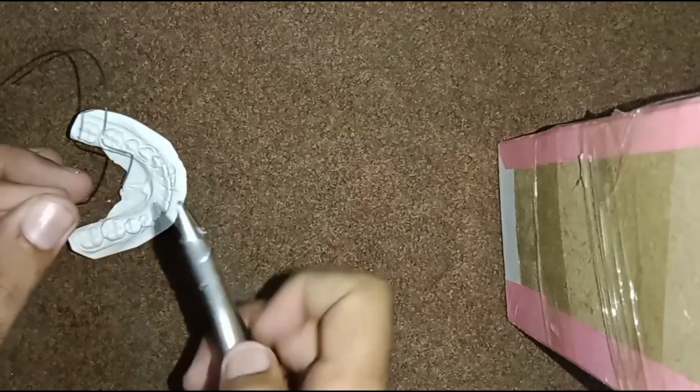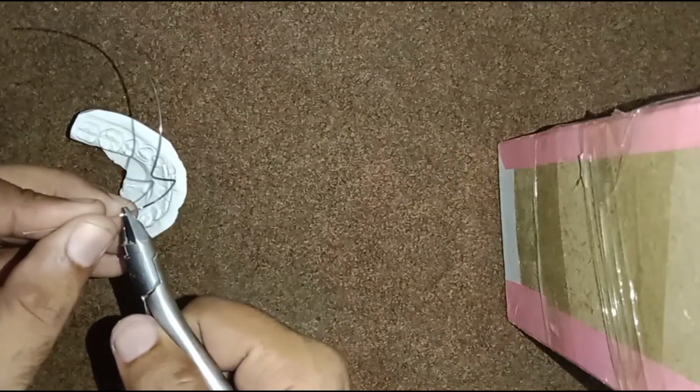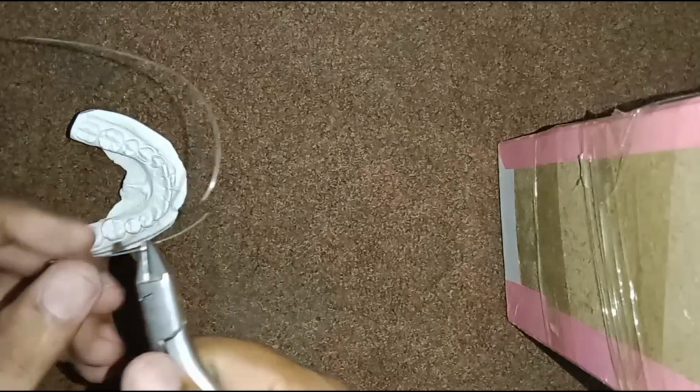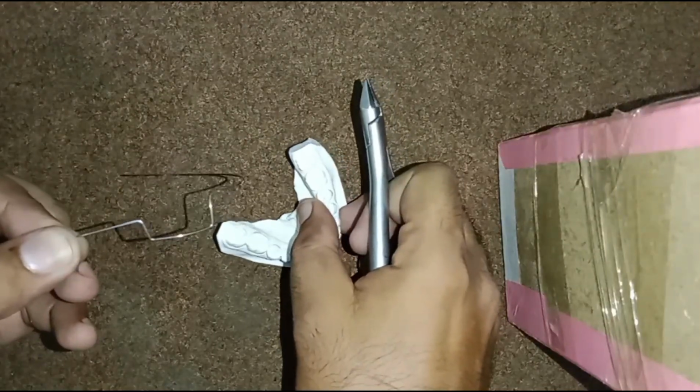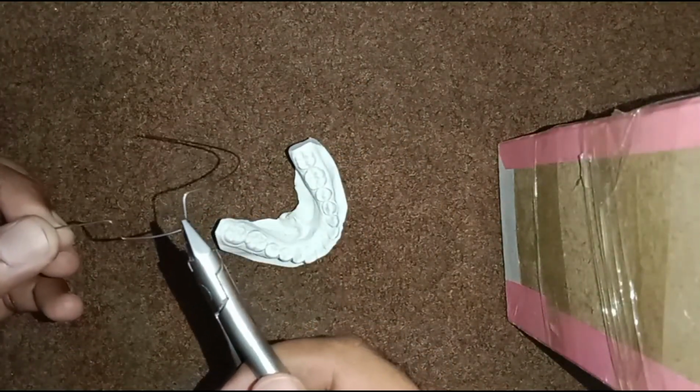Now hold the wire at the 3 mm or 4 mm mark. Give it a 90-degree bend. It will be in this form. Distal to the lateral incisor, the wire goes down.